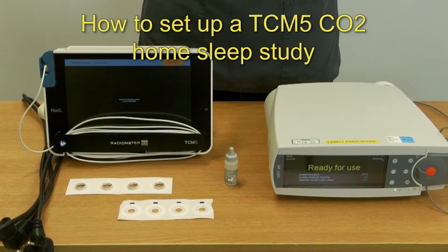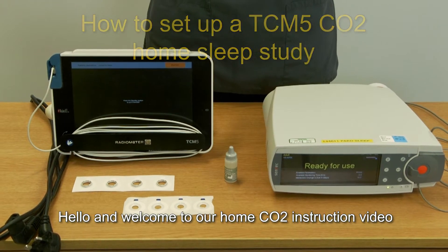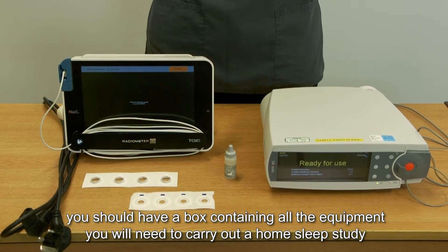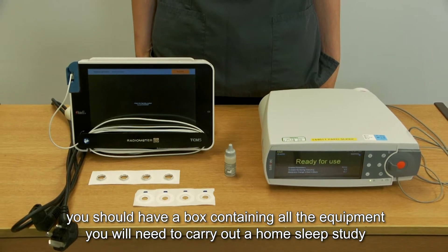How to set up the CO2 monitor for home CO2 sleep studies. Hello and welcome to our home CO2 instruction video. After attending your collection outpatient appointment, you should have a box containing all the equipment you will need to carry out a home sleep study.